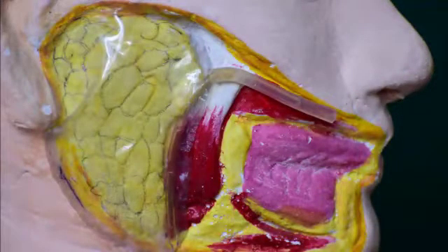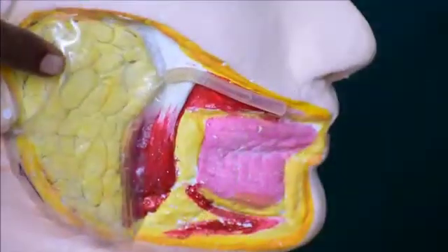This is the model with which we will be proceeding with our demonstration. I am pointing towards the parotid gland, and this is the Stensen's duct.